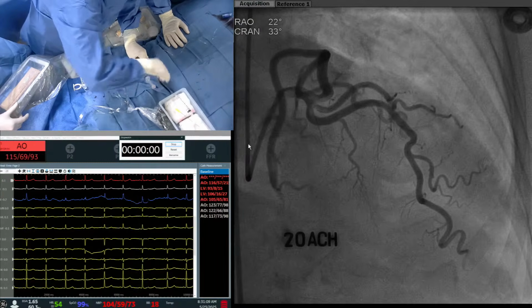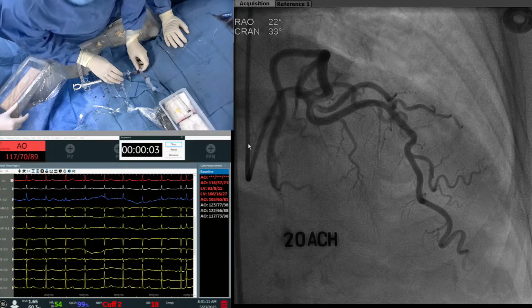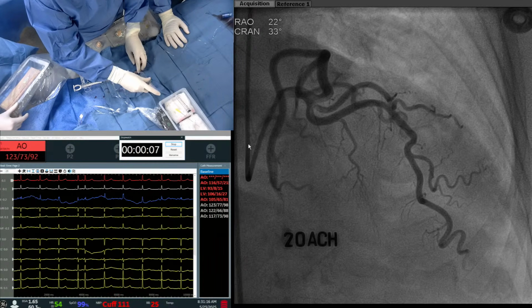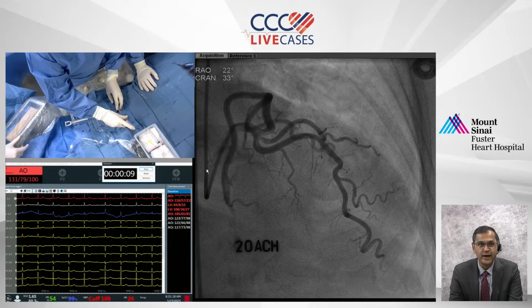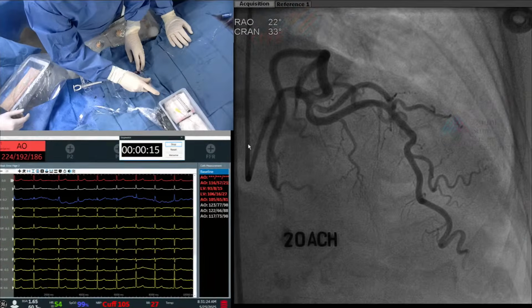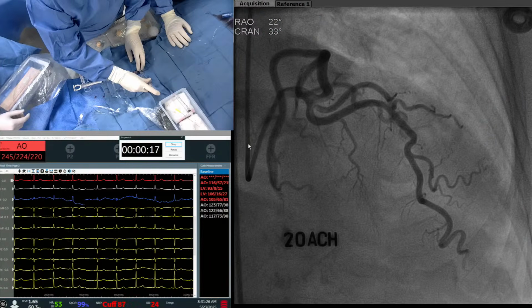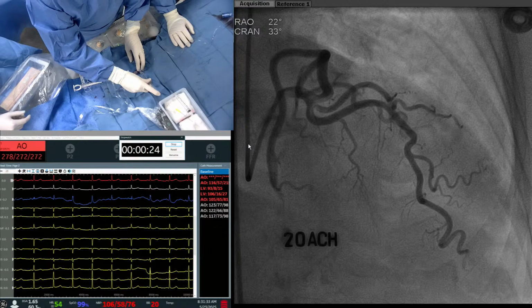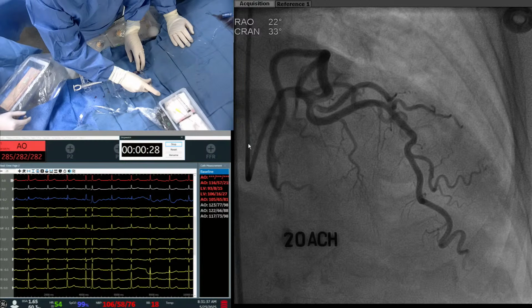That's a great question. Is that predictive of provocative spasm? What do you think? My bias is no. I think it's a mechanical thing from the catheter causing the spasm. We agree, and that's our experience here, that we proceed. Now, the one aspect is a left main spasm. I don't know. Again, I think it's safe to give some nitroglycerin and wait. And as Dr. Moreno said, just do your wire-based testing first, and then you can do your acetylcholine after that.